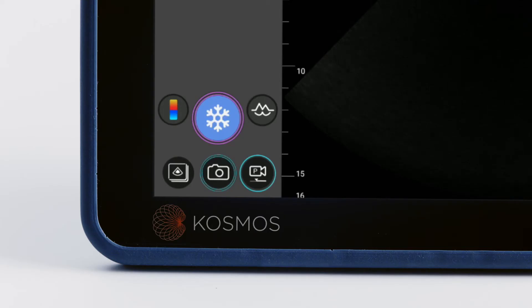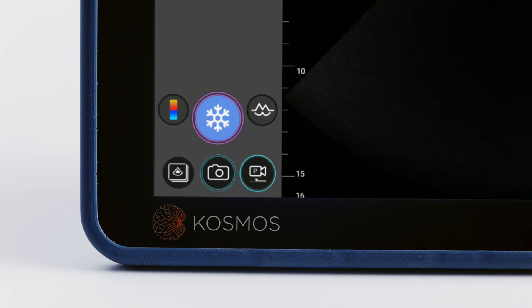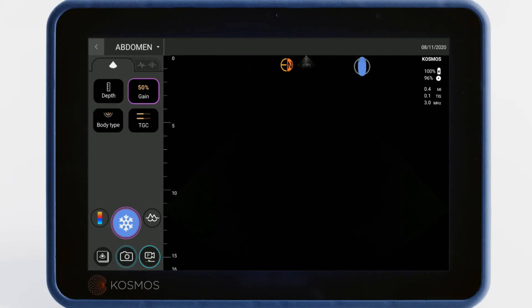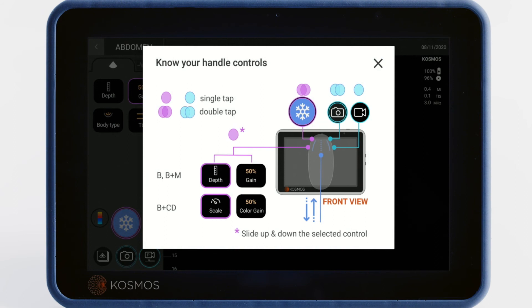There's a clue right on the screen to remind you of the handle controls. Icons with a purple border are controlled by the left button. Icons with a teal border are controlled by the right button. A single border refers to a single tap and a double border refers to a double tap. For a review of the handle controls, tap the blue handle control icon at any time.